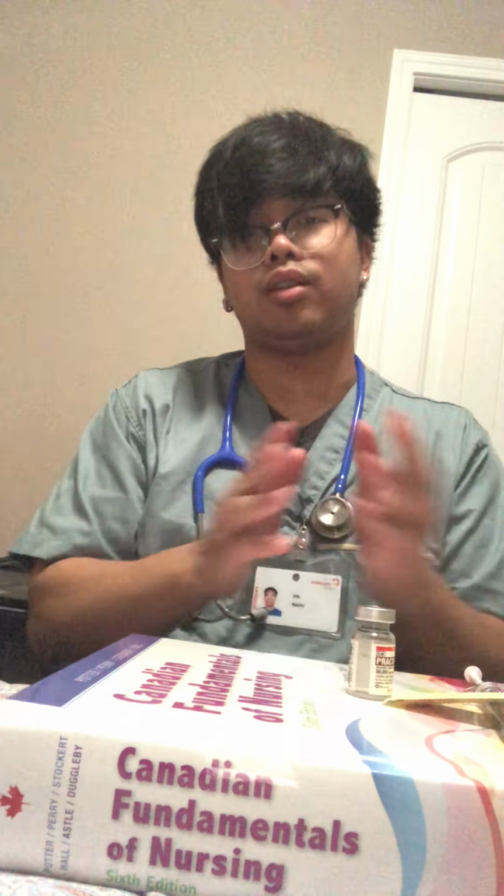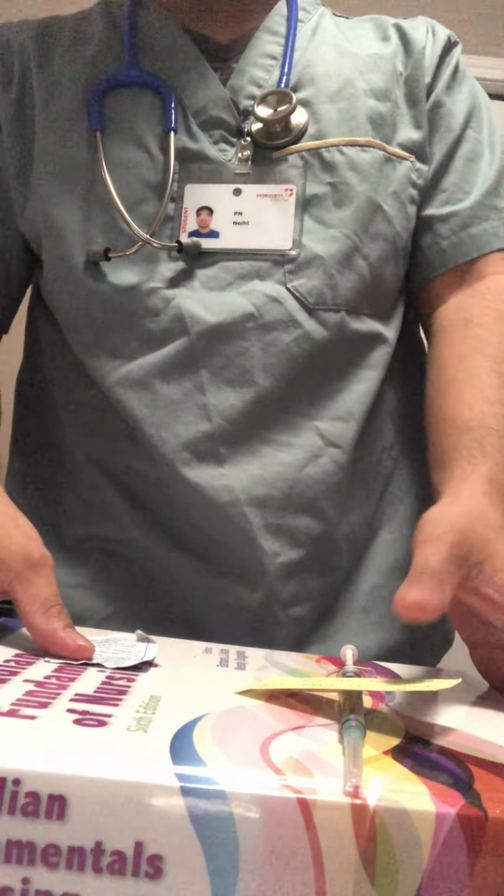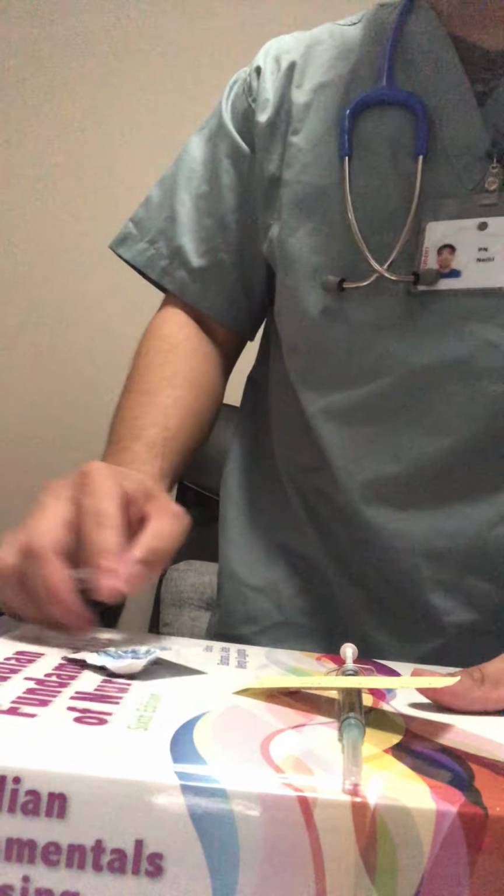Okay, now I can bring everything into my patient room. First I'm going to apply hand hygiene, and this goes to the sharps container. So we have here our tray and our syringe with a needle and alcohol swab.